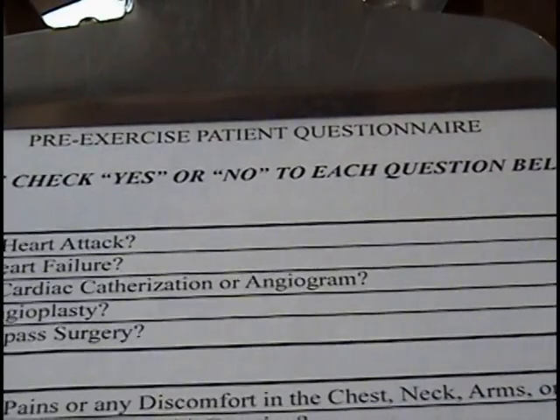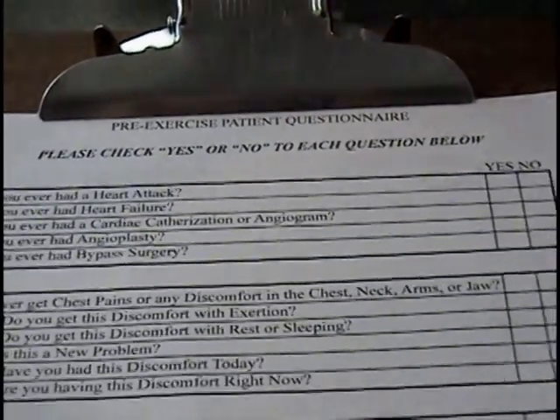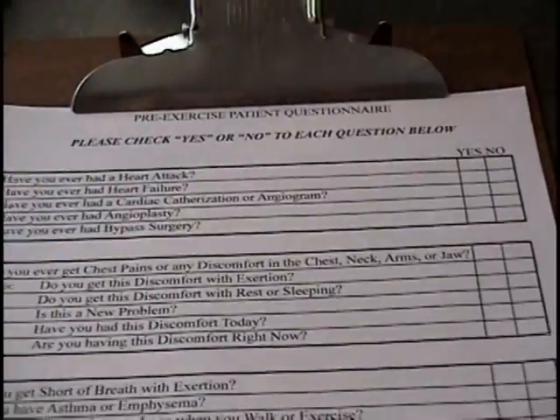On the reverse of the consent is a questionnaire. We do ask that you answer these questions based on how you are feeling at that particular moment.